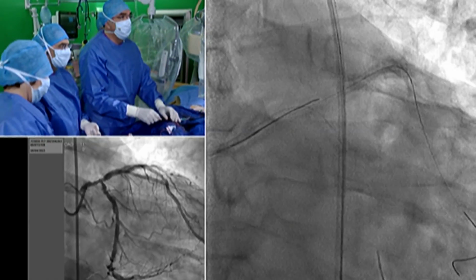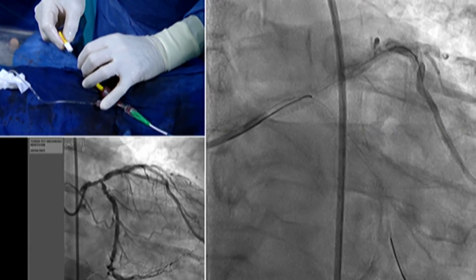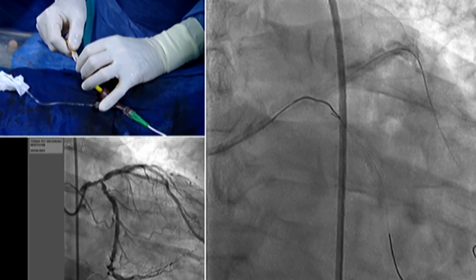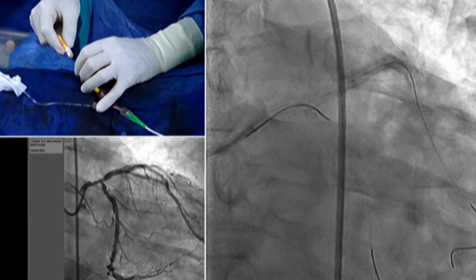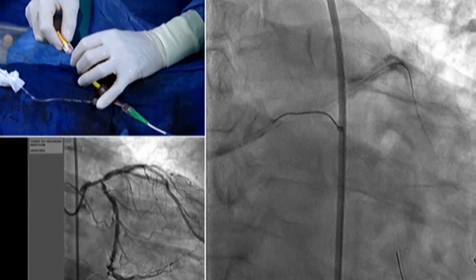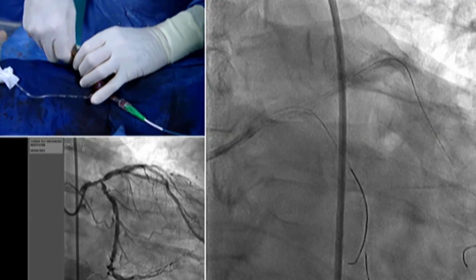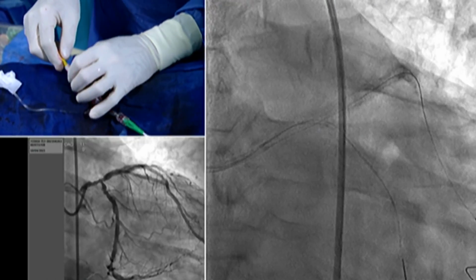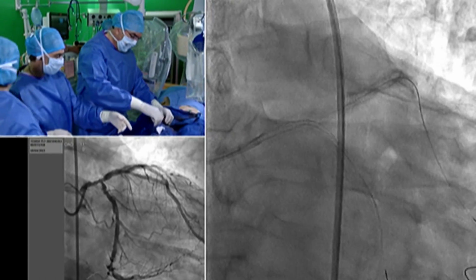And maybe you can test. And now, from the distal to the proximal, we try to get the passage, and so this is correct. There is a lot of friction because of this calcification. It's a really heavily calcified lesion, particularly at the ostium of the circumflex artery. So I placed my wire in the distal circumflex. So this is the white wire.